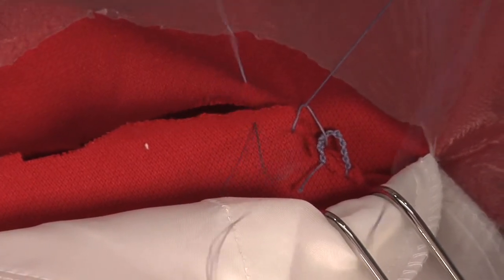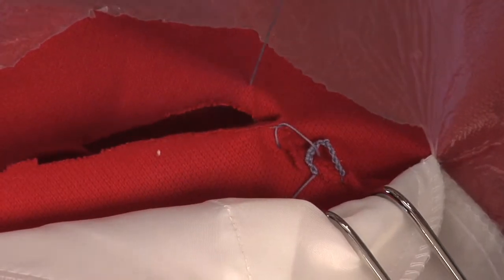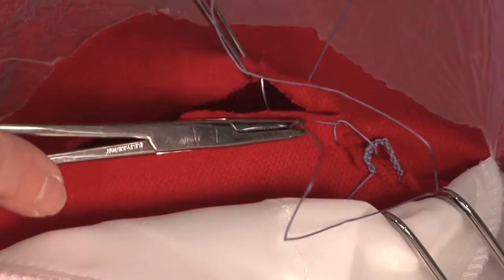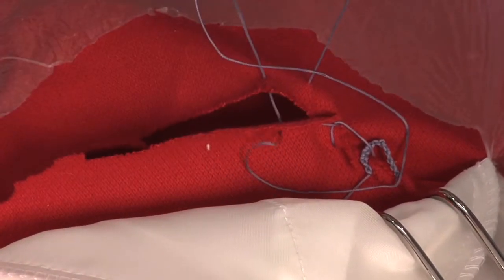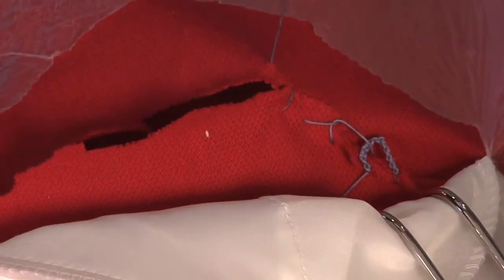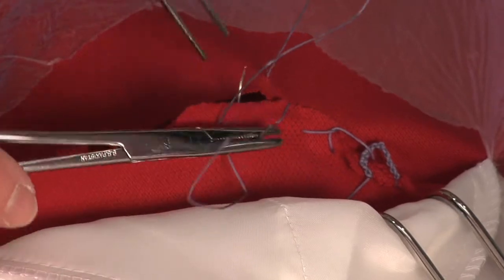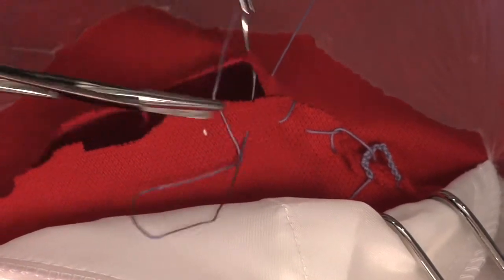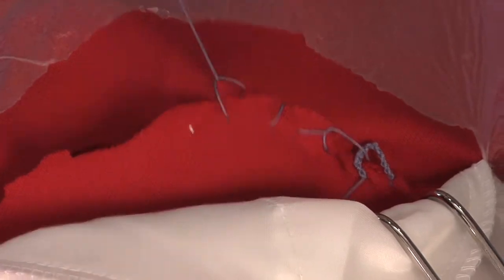Sometimes people wouldn't lock in this layer — that's one of the things we talk about in the discussion part of the course: what proper technique is, should you do it this way or the other way. The other way is what you'd call a blanket stitch if you do any stitching.